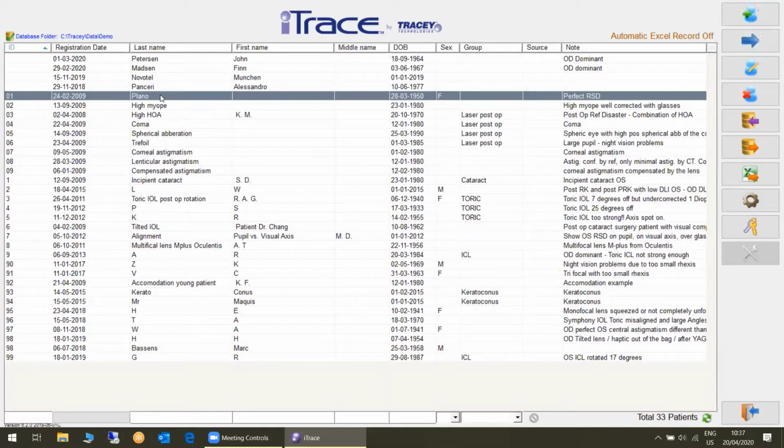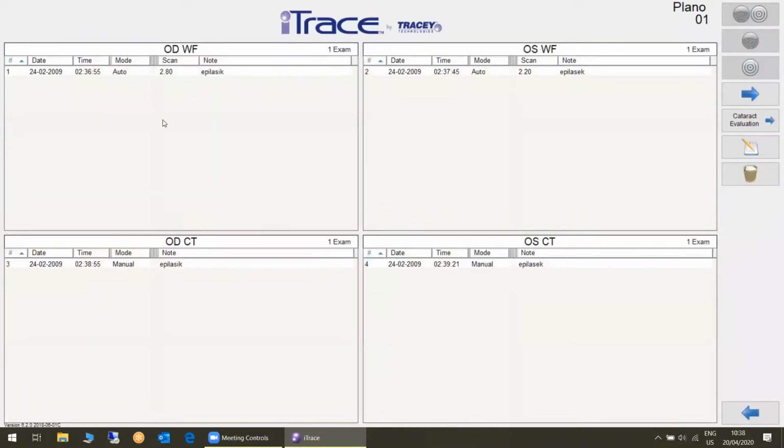Let's start with aberrometry. What is aberrometry? Aberrometry is the technology to understand patients who have problems with seeing well. We have different technologies. The most commonly used is Hartmann-Shack. And Hartmann-Shack has been used for many, many years together with excimer laser for laser vision correction. So if you hear aberrometry, most people automatically think about laser. But that is not really true.